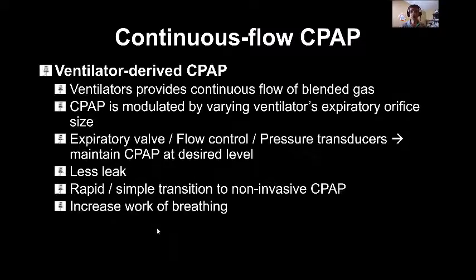The problem is increased work of breathing, because remember, there is a circuit, part of the circuit goes into the nose and or the mouth and out of the mouth. And because you're not using a generator, the patient will breathe. And remember, the flow is given to the patient with oxygen and goes back to the machine, where there is an exhalation valve to provide the pressure. So that means the patient will breathe from the nose back to the ventilator, again through that whole tube. And therefore, there is increased work of breathing.